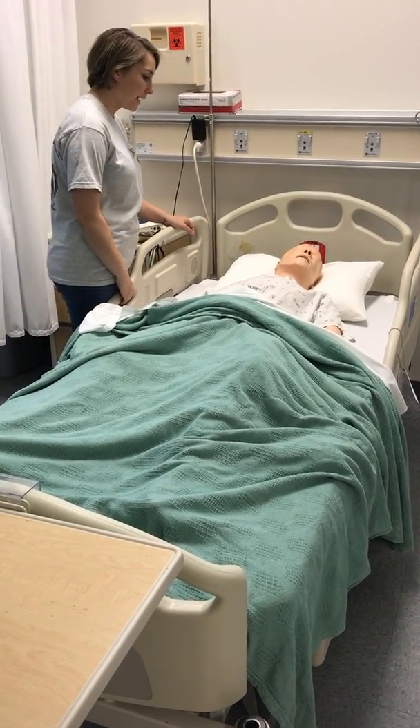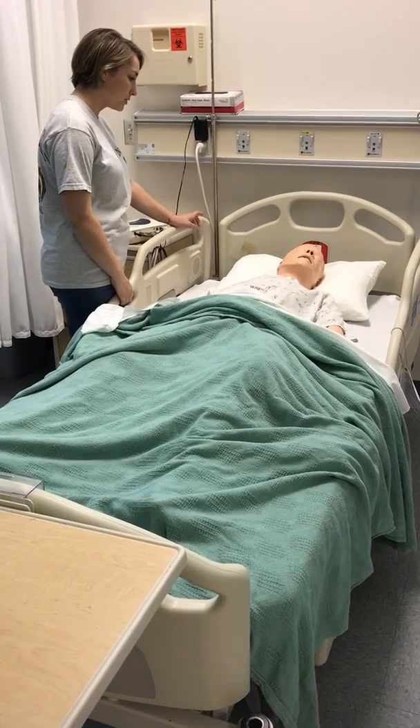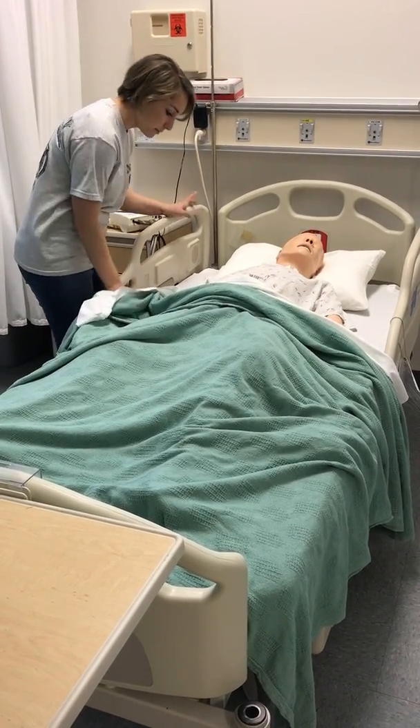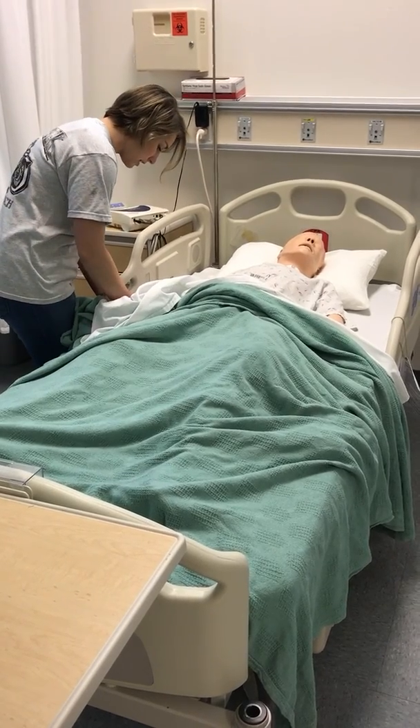Good morning Mrs. Smith. How are you today? My name is Jacqueline. I'm going to be your student nurse. I'm here to put down a Foley catheter for you. Let me check your wristband. Can you please state your name and your date of birth?